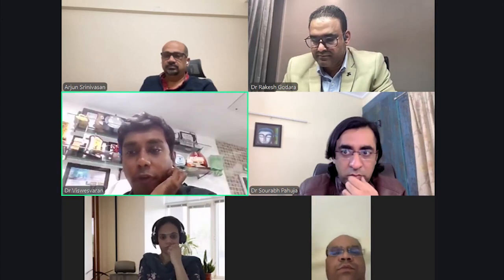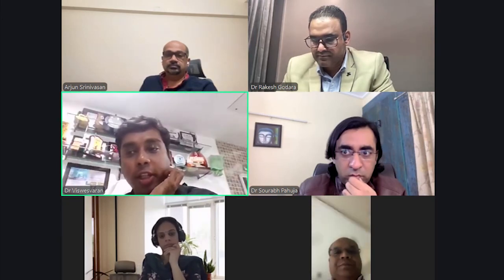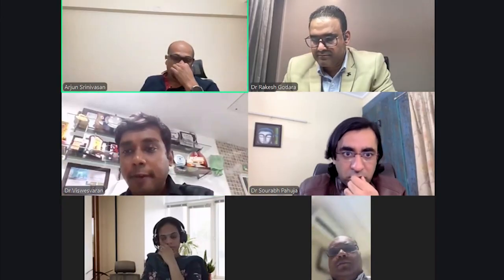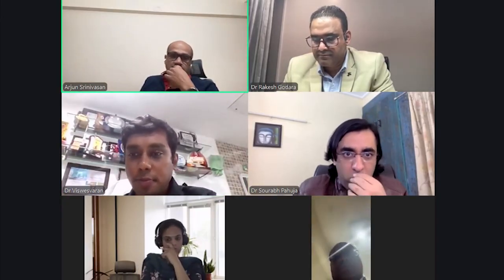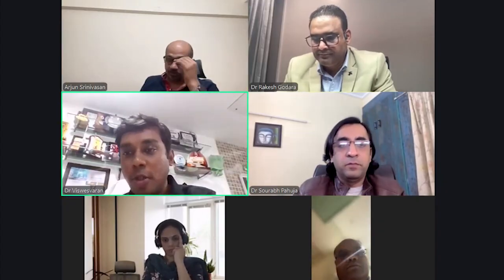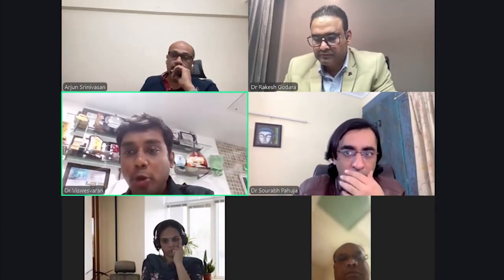And Dr. Muthukumar from Chennai to Dr. Arjun: what are the indications for using hot therapies during FOB? Quick answer, sir, one or two indications. Yeah, tumor debulking, stenotic repair, granulation. Yeah, granulation.